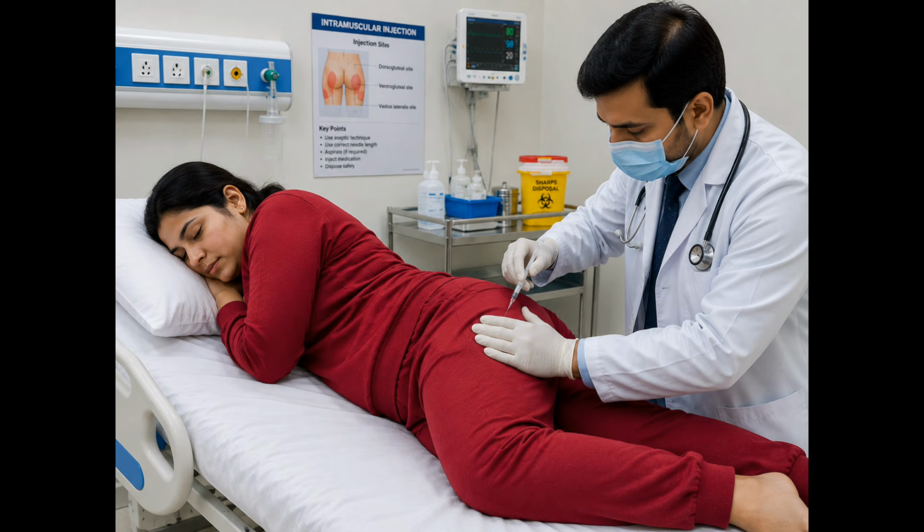Once the medication has been administered, the needle and syringe are immediately discarded into an approved sharps container without recapping. Proper disposal helps prevent accidental needle stick injuries and protects healthcare workers, patients, and the environment.